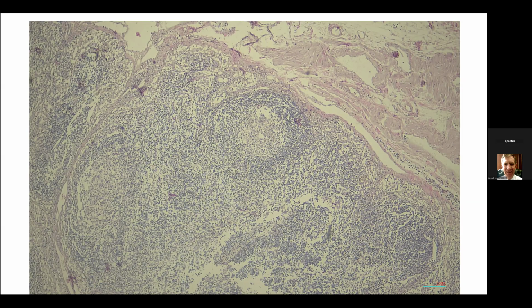I couldn't really classify them as lymphocytes. And this raised my concern, and I was afraid that there could be some sort of immature component which I needed to pay more attention to.